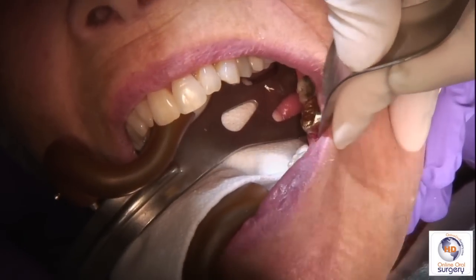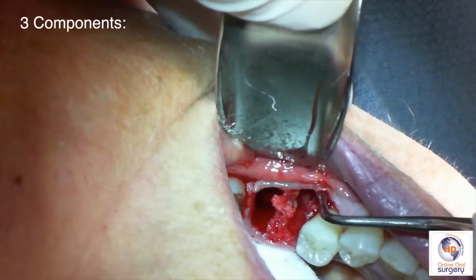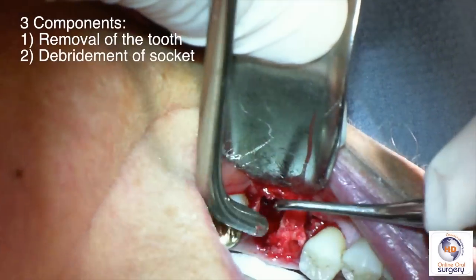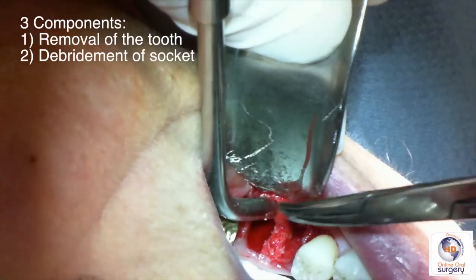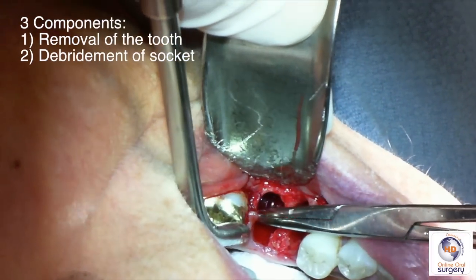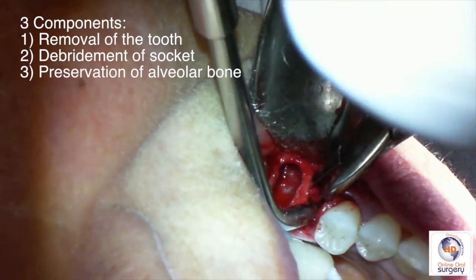Now that the tooth is out, our job is only a third of the way done. I like to think of an extraction as having three components. The first is removal of the tooth itself. The second is to thoroughly debride the socket of all granulation tissue, infected tissue, and any debris that can interfere with healing or may serve as a nidus of infection in the site. The third part of the procedure is to then prepare the socket for the eventual implant — and that's the ridge preservation graft, which we'll do next.